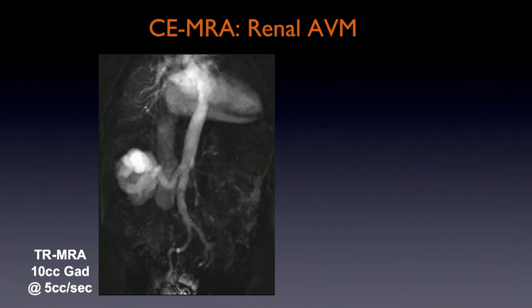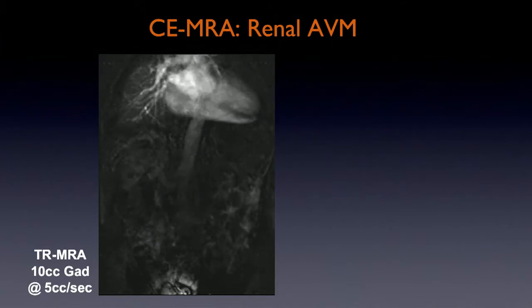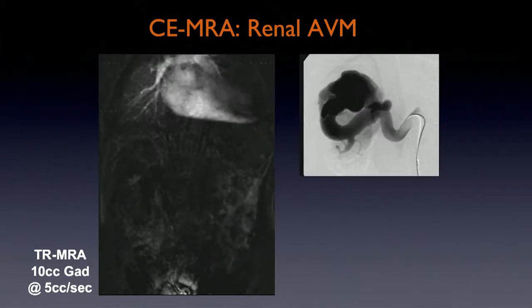This is like an extreme version of shunting in the calves that Giles talked about earlier. It's best to do this with a time-resolved technique, in my opinion. And this is similarly what was seen at angiography.